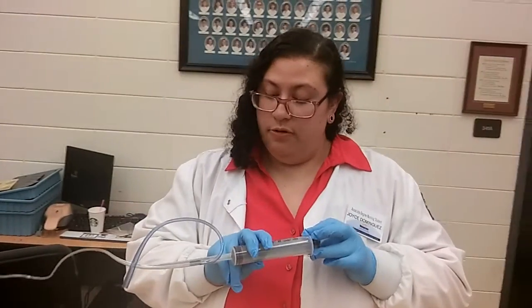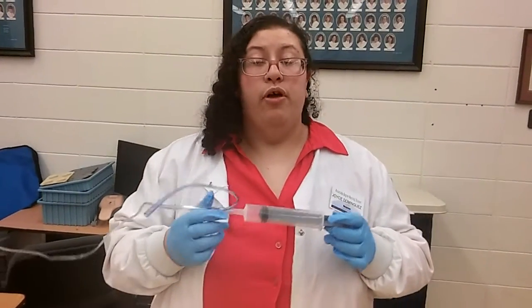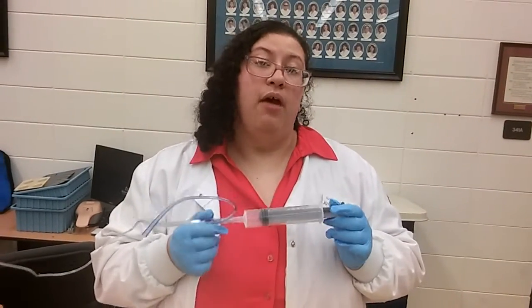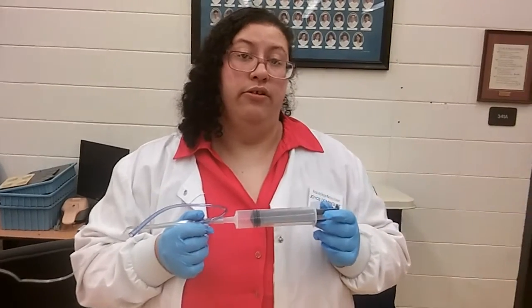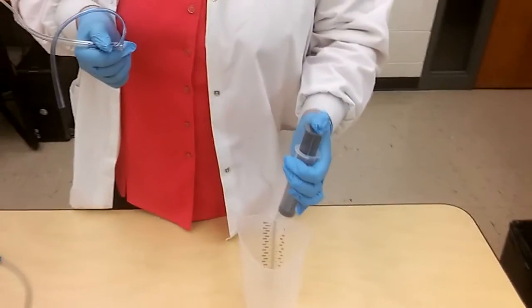Then we're going to aspirate the contents. It is output if the amount is more than what was instilled, and intake if the amount was less than what was instilled. We would normally put that in our graduated cylinder.